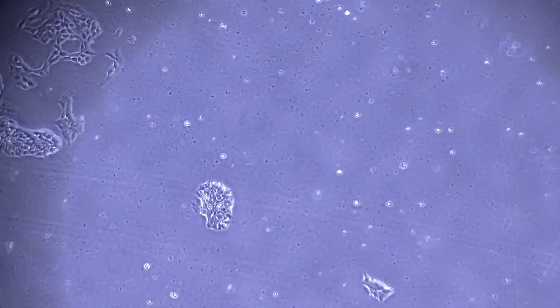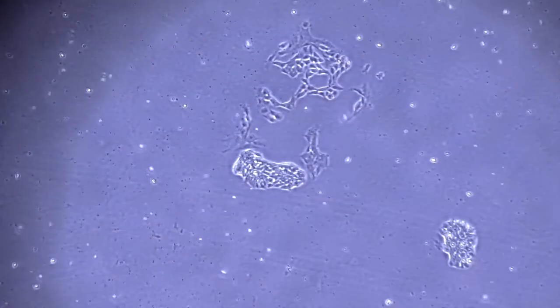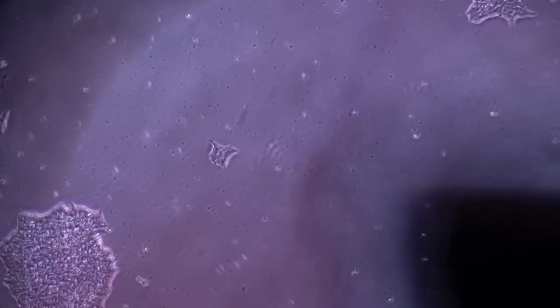Briefly, IPSC colonies are formed by densely packed cells with defined borders. At a higher magnification, it is clear that these cells present a high nucleus to cytoplasmic ratio and have a prominent nucleolus.